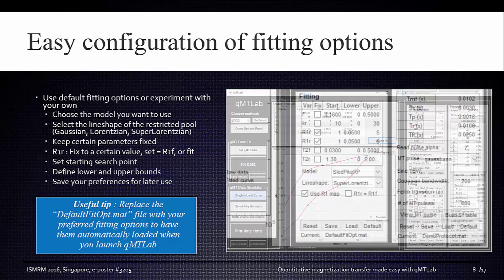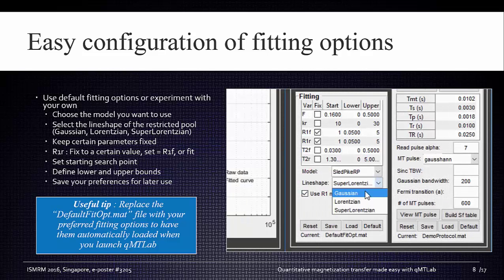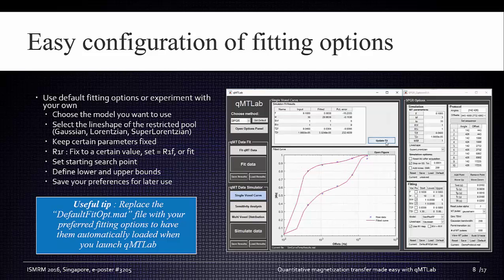Then again, you can save your preferences for later use, and if you save them by replacing the default fit options .mat file, these fit options will be loaded automatically every time you launch qMTLab.